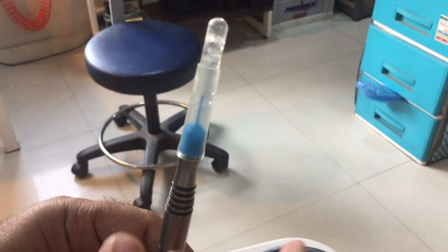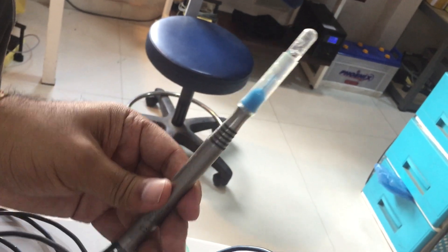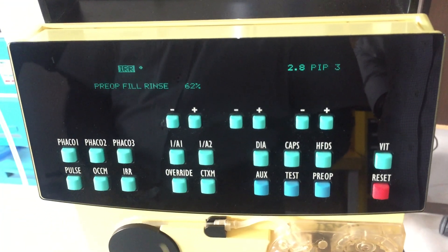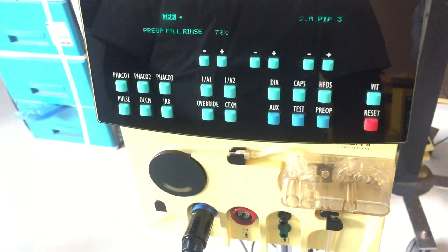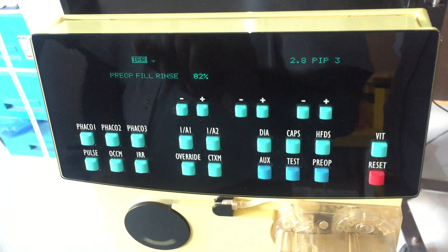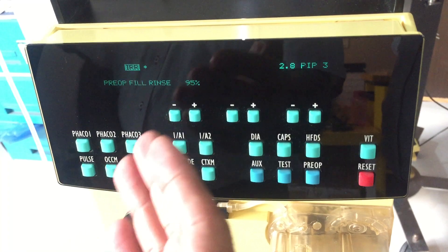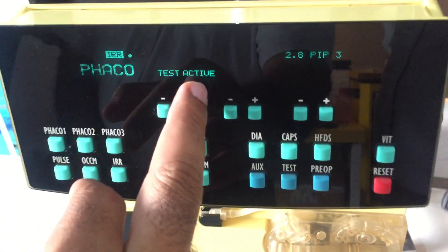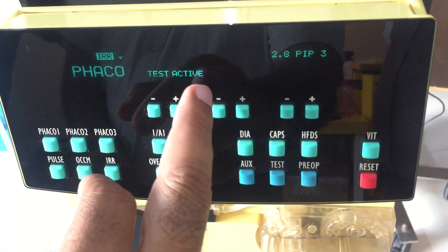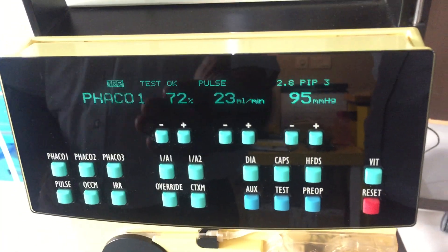Take all the air from the handpiece into the chamber by knocking the handpiece in a vertical direction. Wait until the system shows the message 'okay.' The pre-op fill and rinse is running and here is the percentage of completion. After reaching 100%, it will show 'FECO test active,' then the message 'FECO test okay,' and you will also hear the noise of the ultrasound from the handpiece.